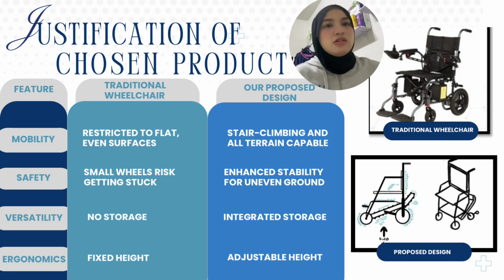As you can see, traditional wheelchairs are limited to flat or even surfaces. Our design can be used for stair climbing and is all-terrain capable. Not to mention that traditional wheelchairs have small wheels, which also cause the risk of getting stuck on the road. In our design, we enhance stability on uneven ground. Traditional wheelchairs also don't have storage, and in ours we insert storage into the wheelchair. And our main advantage is that we can adjust the height of the wheelchair.